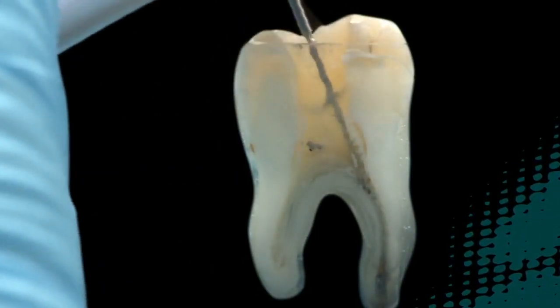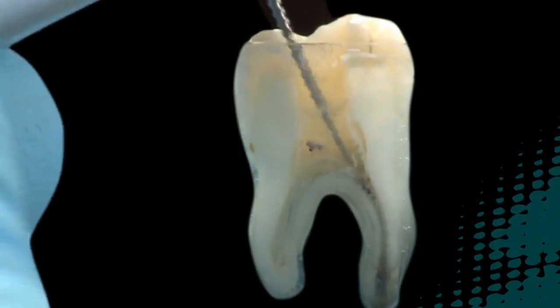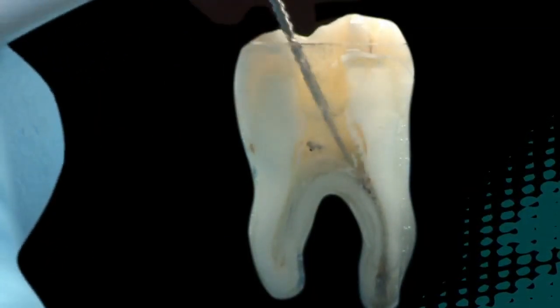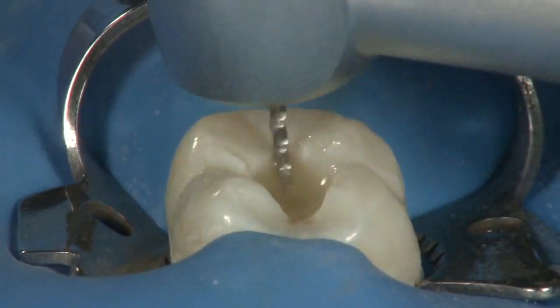NiTi is the alloy used in this portion of the procedure because it possesses the flexibility that is often required to negotiate curves and reach the apical portion of the canal, especially with larger diameter files. At this point, you will have enlarged the canal to a number 25.04 taper.